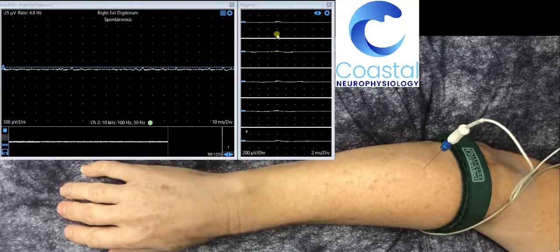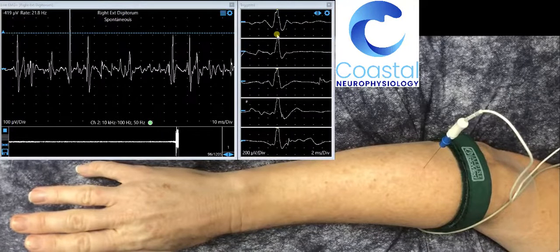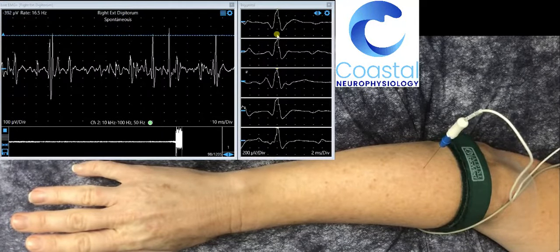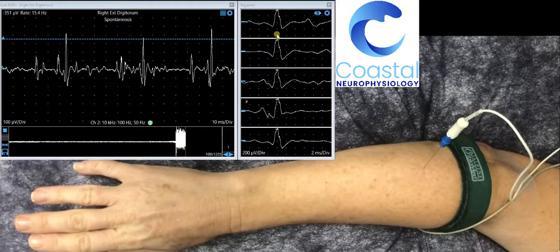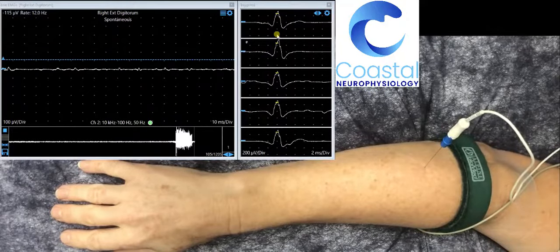If we ask her to activate her muscles by extending her fingers, we can see an increase in the electrical activity on our screen. When she relaxes her hand again, it goes quiet.